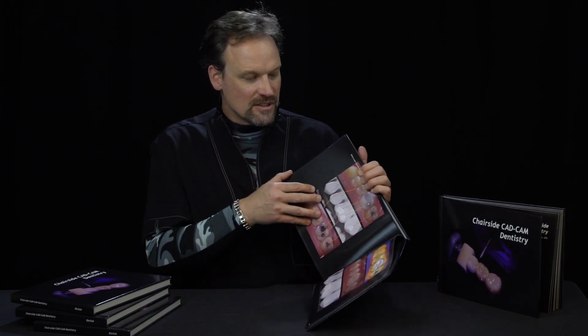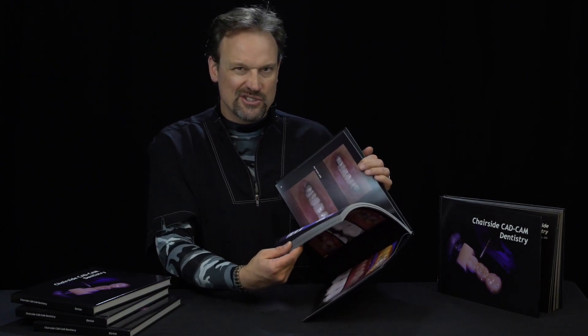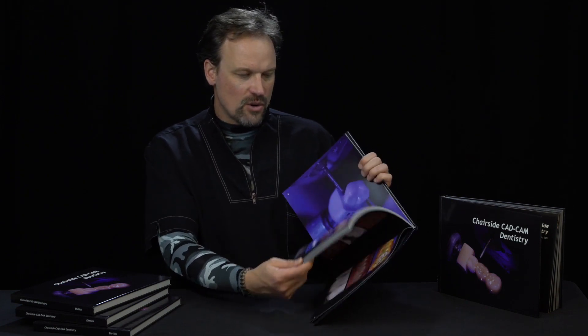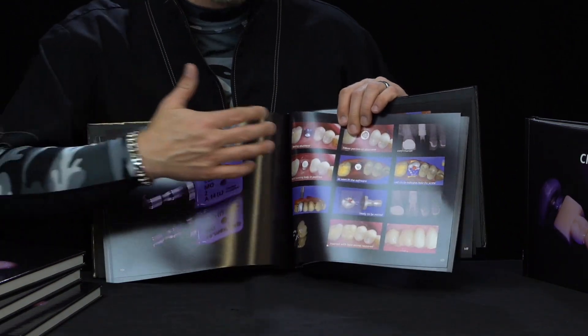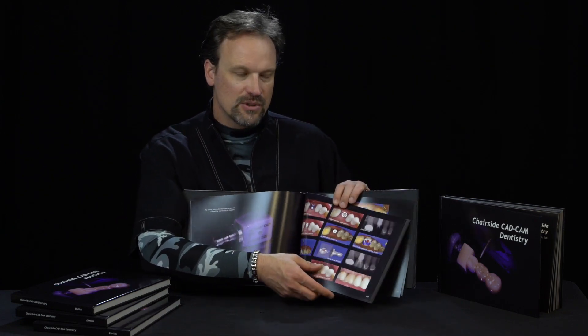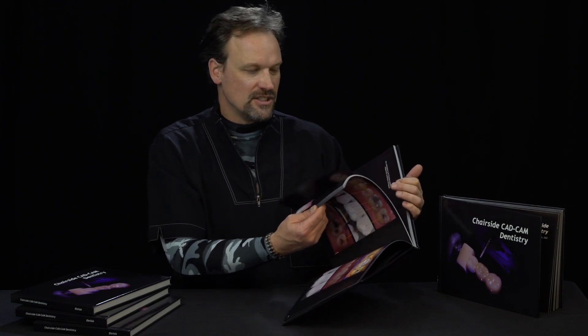The rest of the book has different sections. The first portion is a lot about the history of CAD-CAM — interesting, mostly flip-through stuff — and a lot of quadrant posterior things. There's a big section on implants with a number of pages that walk through the entire implant procedure. This is just the restorative part — no blood and guts — it just shows the before and after doing it digitally.